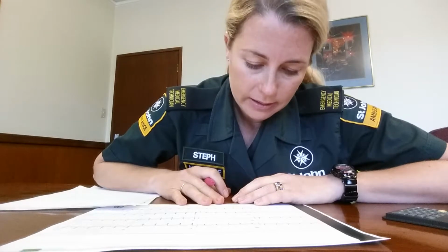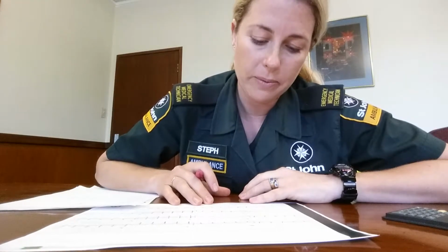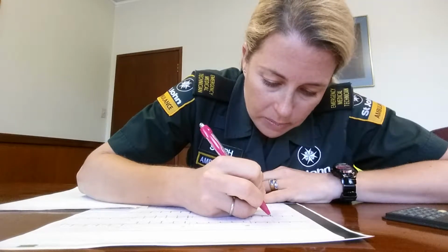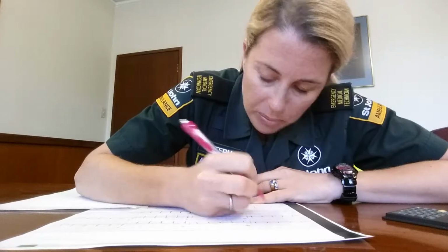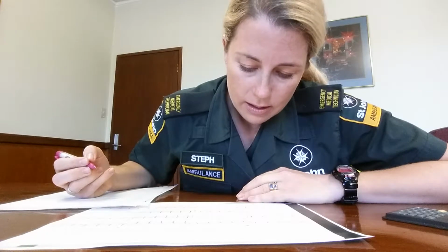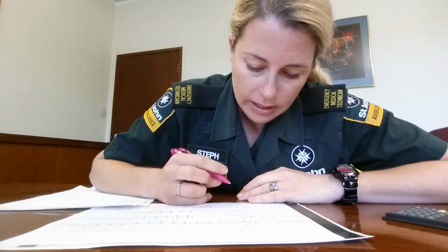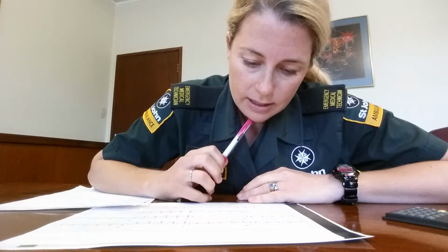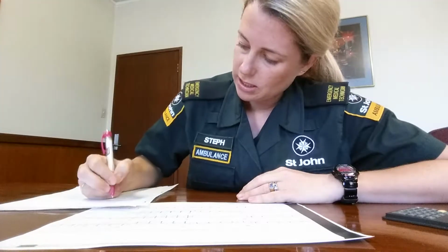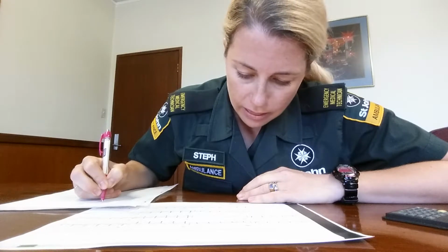My QRS complex, I'm looking for it to be less than 0.12 seconds, so normal 0.06 to 0.11 seconds, which it is, not wider than that. It is about 0.11 seconds, which is normal. My ST segments, I'm looking for elevation or depression greater than 1 mil in contiguous leads in the limb leads, which I do have, elevation in 2, 3, and AVF.